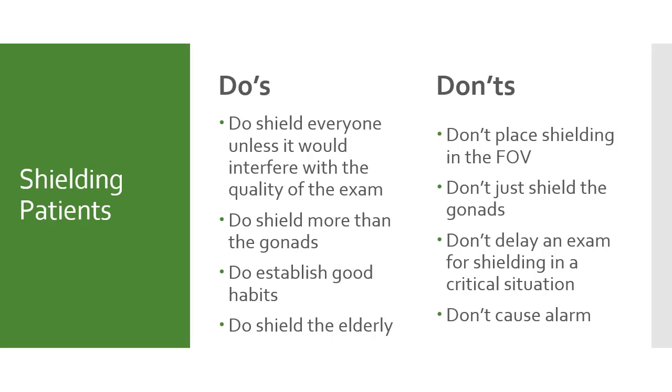And lastly, don't cause alarm. What does this mean? If you're in a room and you notice a technologist not shielding a patient, do not call them out on it in front of the patient. This could alarm the patient as to something being wrong. There may be a reason why the technologist did not shield the patient. You may just not be aware of what that situation is.